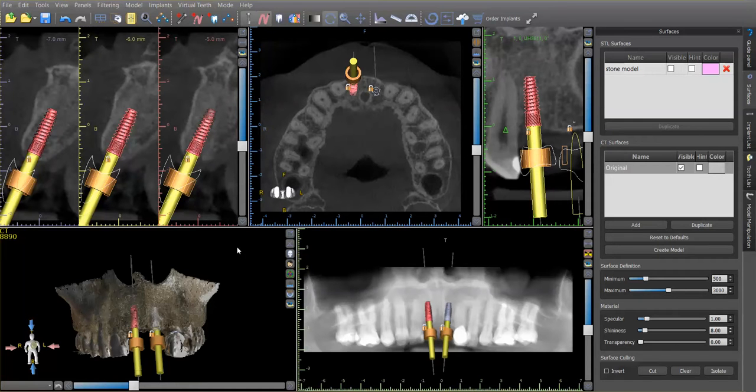The patient would love to be able to leave the procedure and actually have teeth in his mouth. So what we're going to do now is going to allow us to create a model where we can do that.